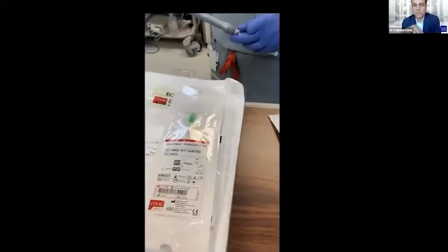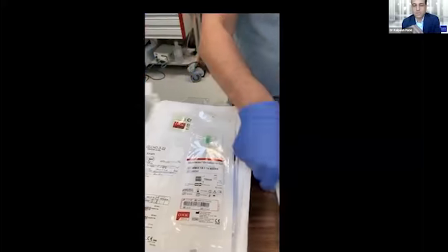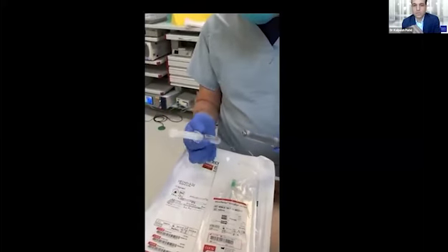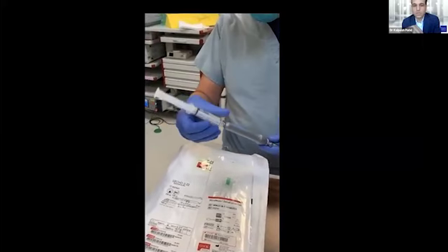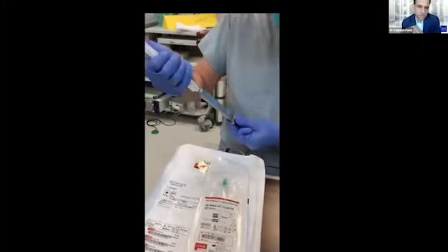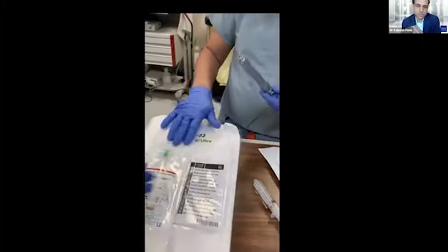So to begin, I'm going to remove the stylet. And we're going to always flush the needle with saline before inserting the coil. This helps prevent any friction with the coil as it's being deployed. Okay, and we'll see a little saline coming out. Perfect. Next, Susie, if you could open the 10 millimeter coil.